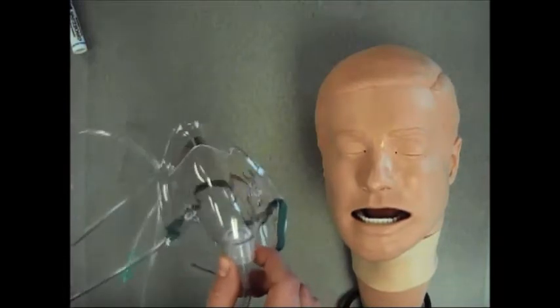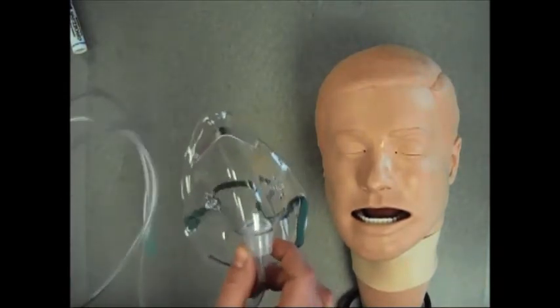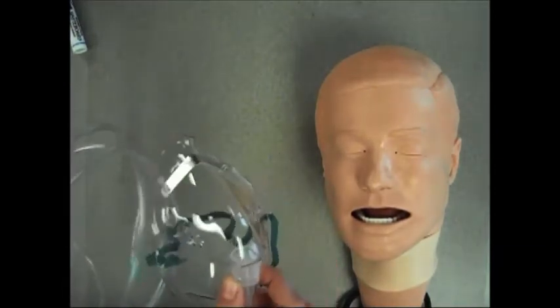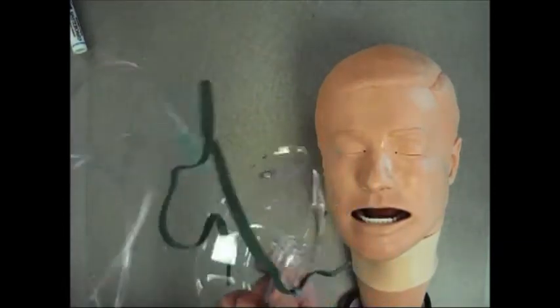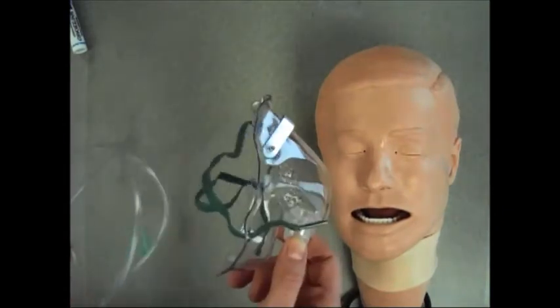Before applying the mask to the patient, always make sure that the oxygen supply has been turned on and is actually flowing through the oxygen device.